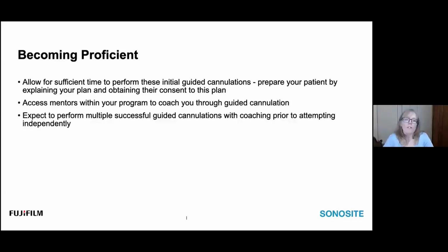Allow yourself sufficient time to perform these initial guided cannulations. Prepare your patient by explaining your plan and obtaining their consent to this plan. They might be completely frustrated because of things that happened during their day, and their ride was late and they're getting on late and they don't want that to be used. We have to respect if they say no, then no it is.